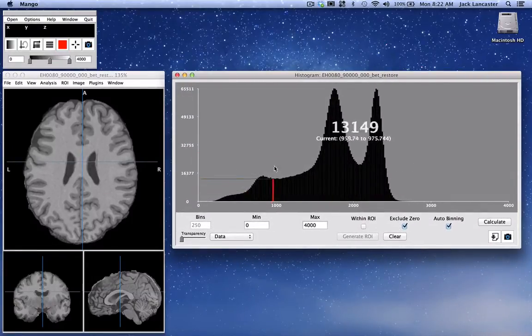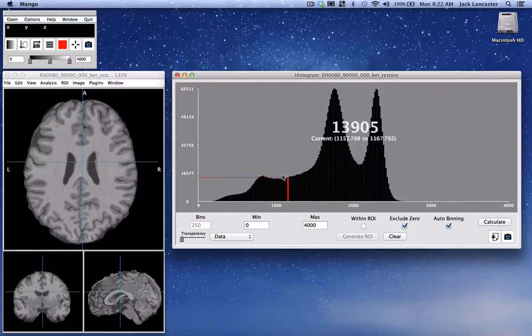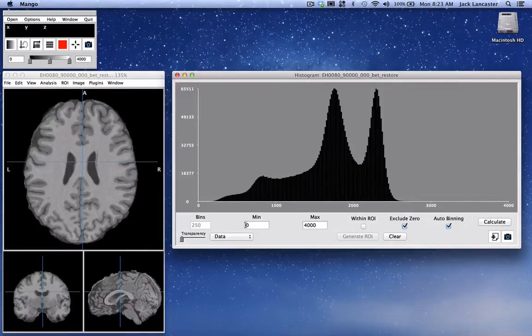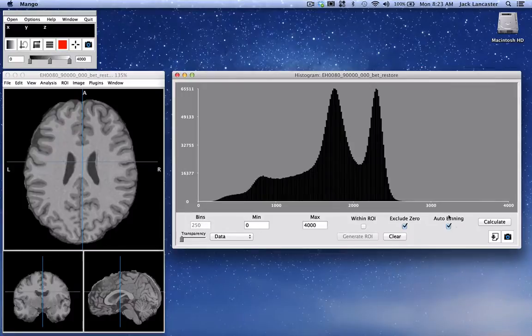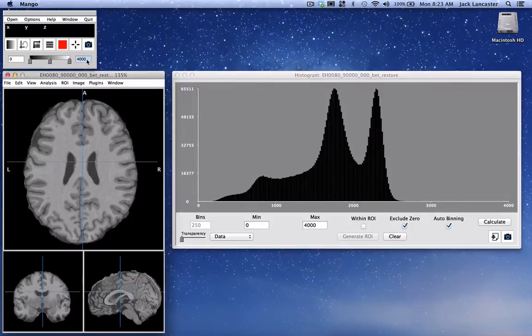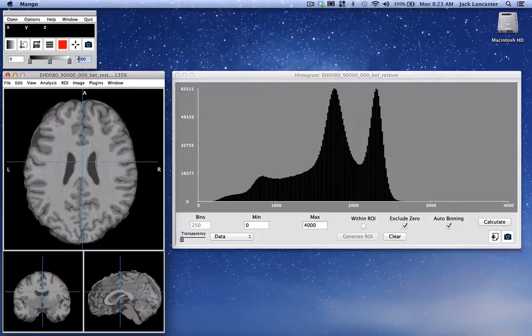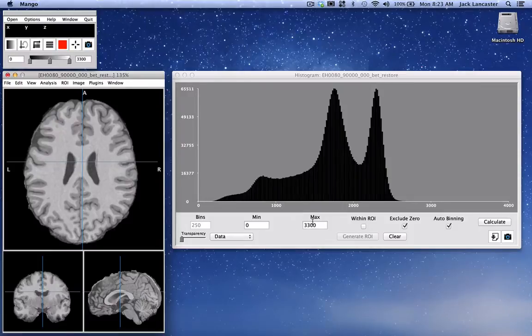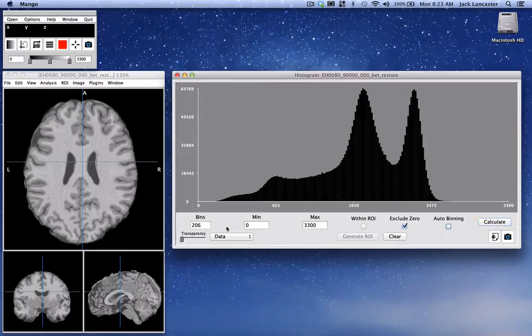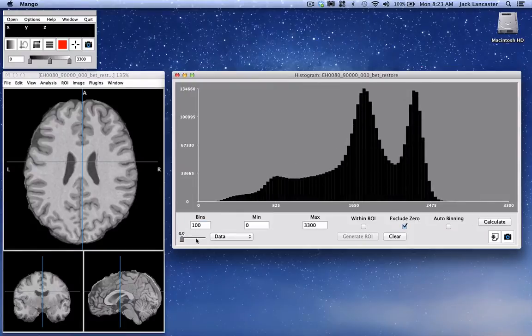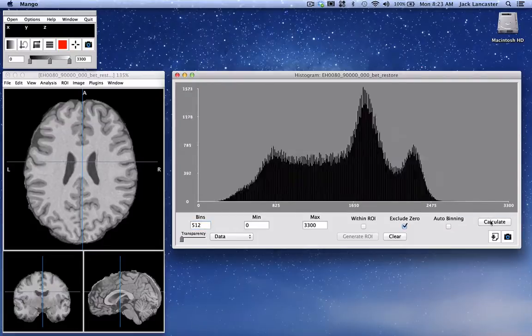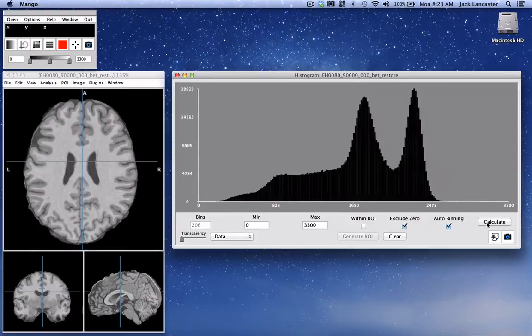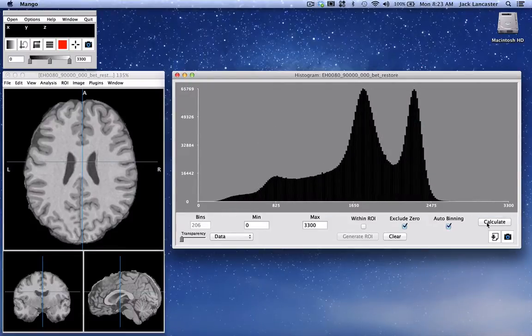We've set up the image display to go from 0 to 4000 and that's automatically passed along to the histogram analysis. What I want to illustrate is auto binning. We're going to change the range here because we have a lot of blank space up at the top of our histogram. If we don't use auto binning we have to pick a proper number of bins. Too few and you get something like that. You can pick a lot more and sometimes it works quite nicely, other times you get some little specky looking things, so we're going to leave it in auto binning mode.